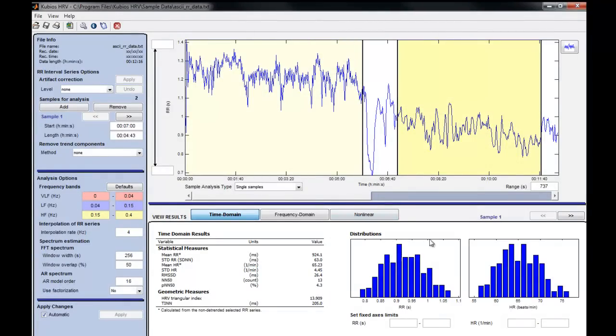If you look on the bottom here in the middle, we have a graph of the standard deviation of RR intervals. Now, if this plot or this normal curve was narrow, meaning all these bars were centered around the 0.9 second, then that means that there wouldn't be much difference from one RR interval to the next. They would all be around 0.9, and therefore your standard deviation would be small. But if you get a distribution such as this, which is more spread out, you can see that any given RR interval is probably different from another one. So the greater the spread of this curve, the greater the difference between any two RR intervals, which means the greater the variability. Therefore, a greater standard deviation of the RR frequency plot is a greater heart rate variability.